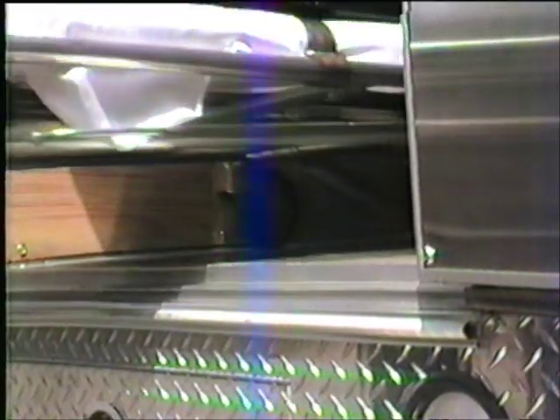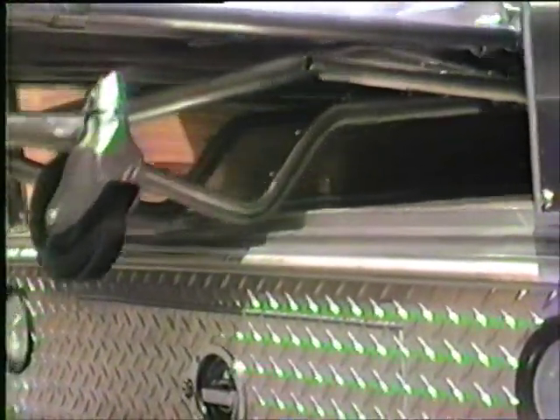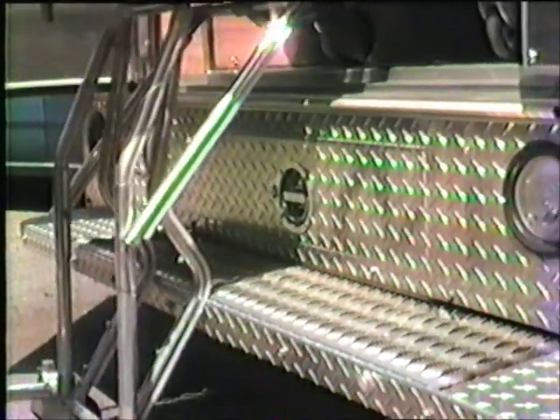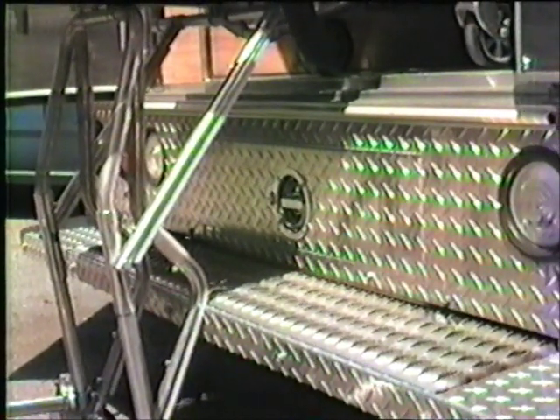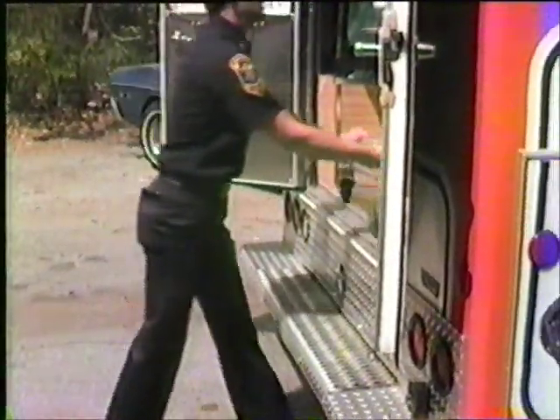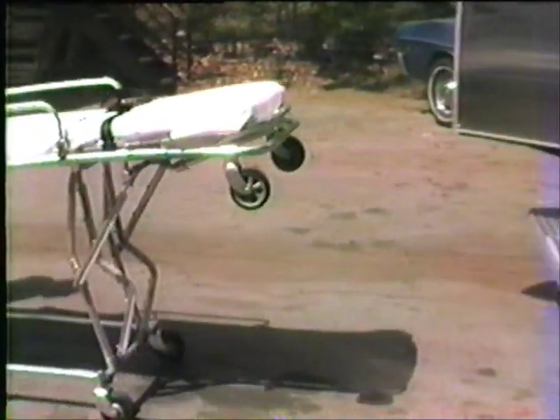The 29M roll-in cot has poly strips on the undercarriage to prevent metal-to-metal contact with the bumper when rolling in or out of the vehicle. These poly strips can be the first clue to over-abusive use of the 29M roll-in cot. It should be noted these strips should slide smoothly over metal. Their service life and the stretcher's safe functional life is reduced greatly when they are used as shock absorbers and the cot is slammed into the rear of the ambulance or jerked out.